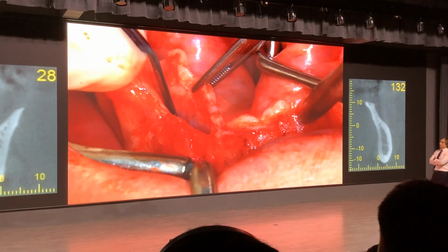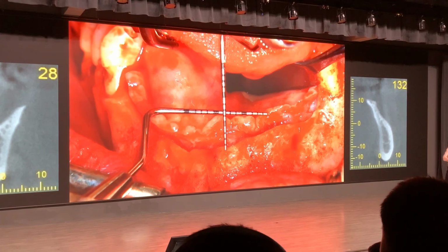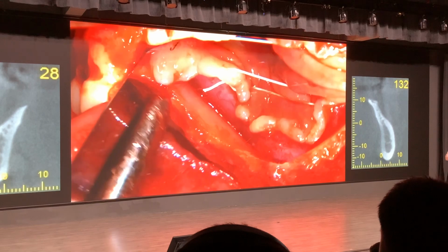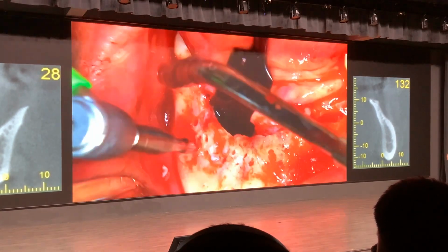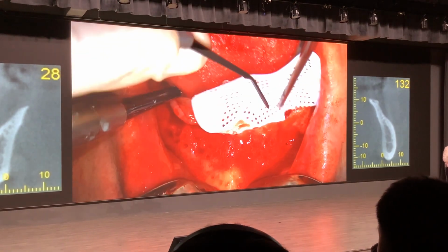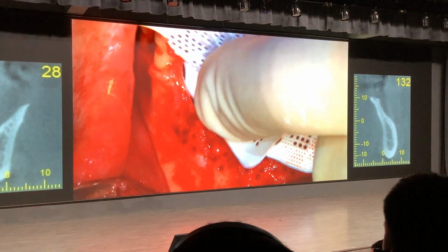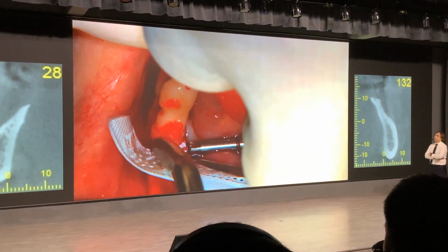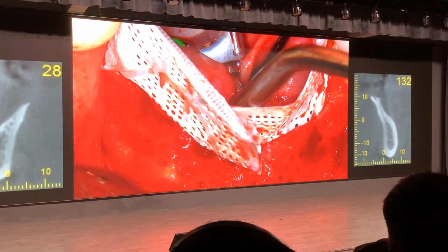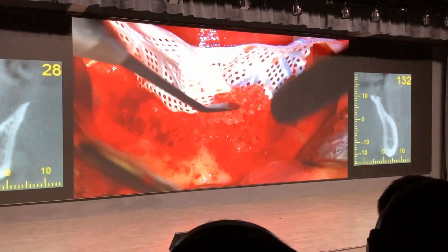I'm going to go on the lingual. I think the LED screen cannot follow the video. Okay, I'm going to fixate on the lingual. Very easy to fixate with a handpiece. 100 RPM, it's in. Look how much bone I scraped. I used 4 scrapers.